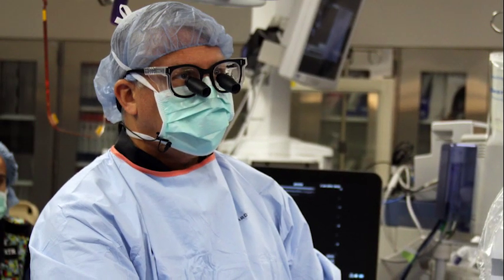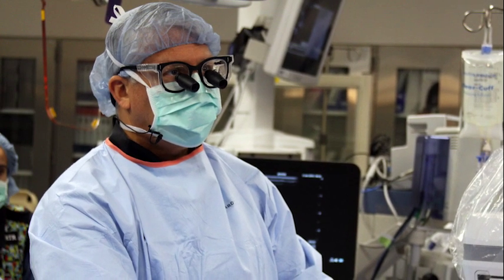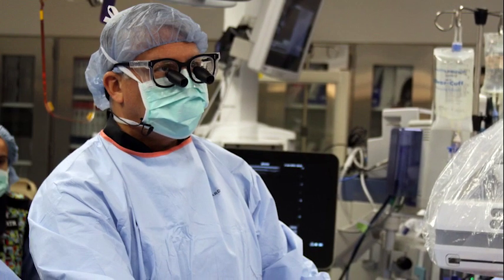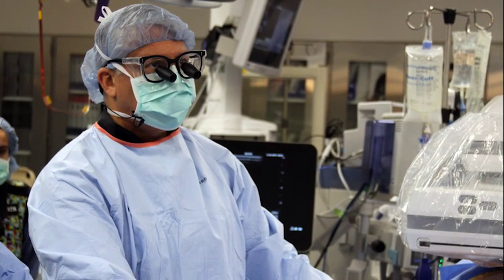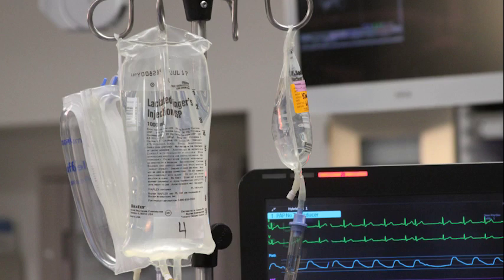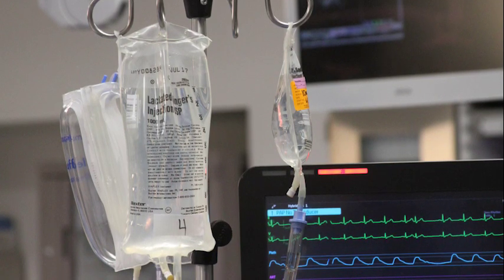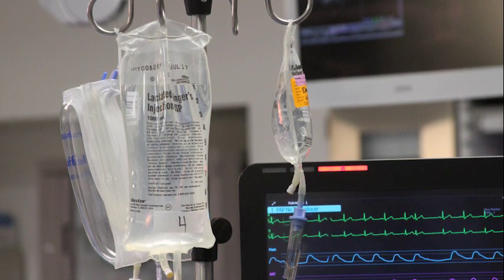The physician will scrub in and obtain arterial access, perform diagnostic angiograms, evaluate the aortic aneurysm with IVUS, and treat the aneurysm with an endograft. The nurse will administer heparin and monitor the patient's vital signs and clinical status. If using conscious sedation, the nurse will administer the appropriate medications.